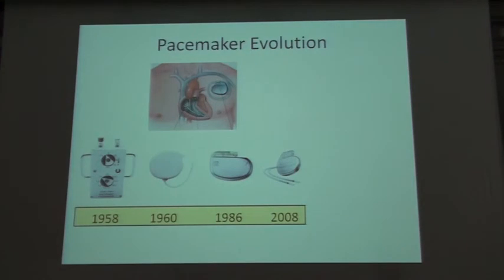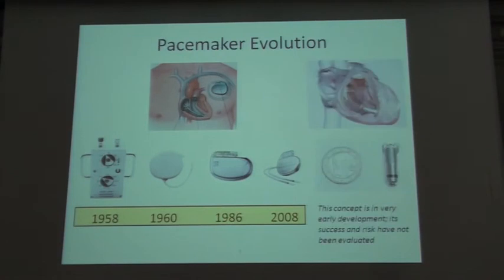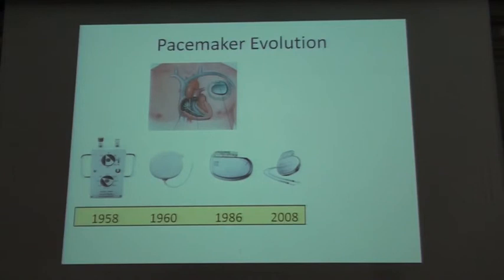Over most of the course of Medtronic's existence, we haven't been very good at delivering solutions that would be able to be used in the lower and middle income economies. We've really had our hands full to take, for instance, the pacemaker from something that was outside the body with leads to something that was implanted, and finally something that's small enough to be deployed pectorally without really bothering arm motion and really not bothering the patient too much, with leads that can be put in as an outpatient procedure.